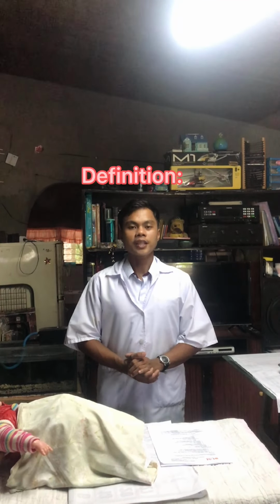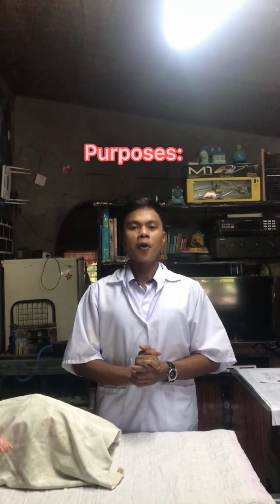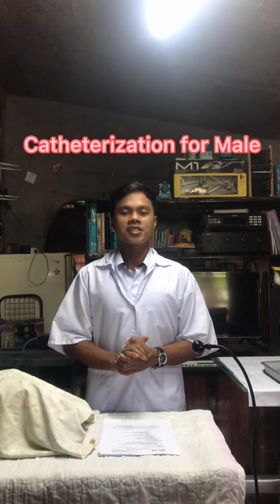Today, I will perform the urinary catheterization. The definition of it is the introduction of a urine catheter through the urethra into the bladder for instillation and removal of fluids. The purposes of it are to relieve urinary retention, to obtain sterile urine, to provide access for instilling medication into the bladder, to maintain an empty bladder during surgery, and lastly, to monitor urine output in an ill client. And now let's perform the urinary catheterization.